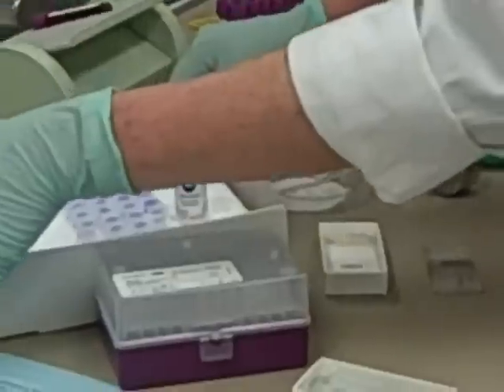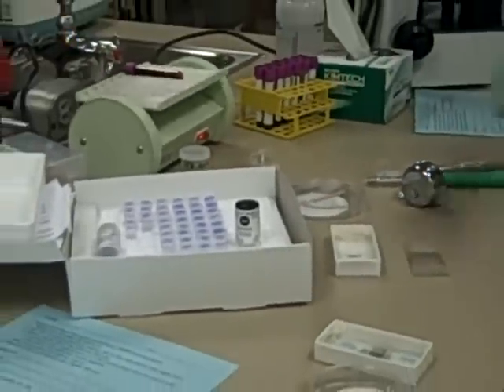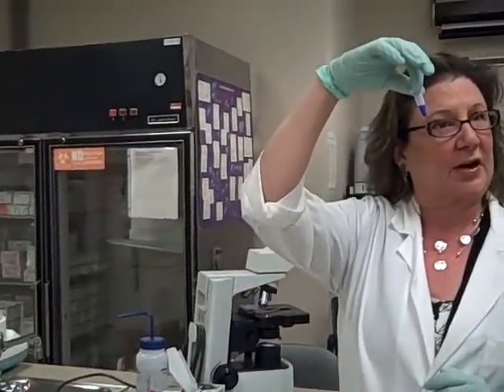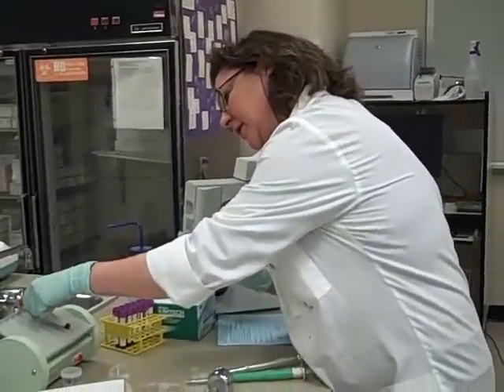This is called the LeucoKit, and this is what has replaced the Unipets for the most part. As you can see, they come in a little vial. The diluent is already pre-measured, so I'm going to take this and label it with my ID.